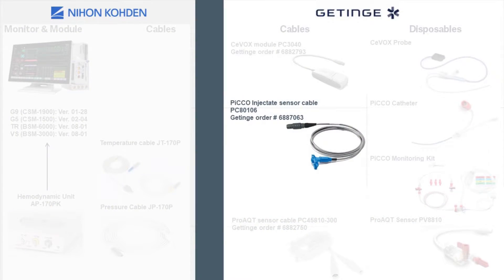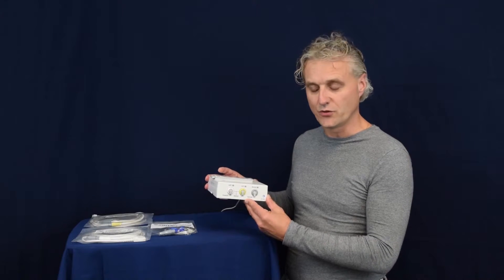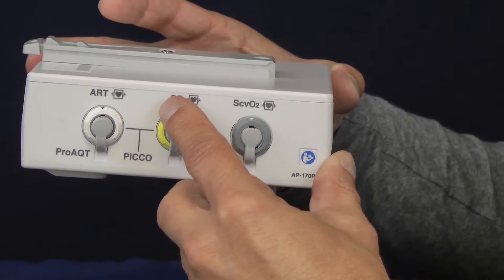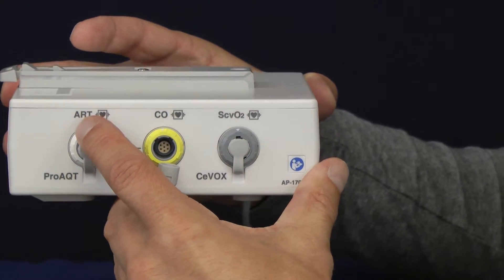The PICO injectate sensor cable is provided by GATTINGER. When using the PICO technology you need to remove the following caps: from the yellow one, and from the white one on the left.